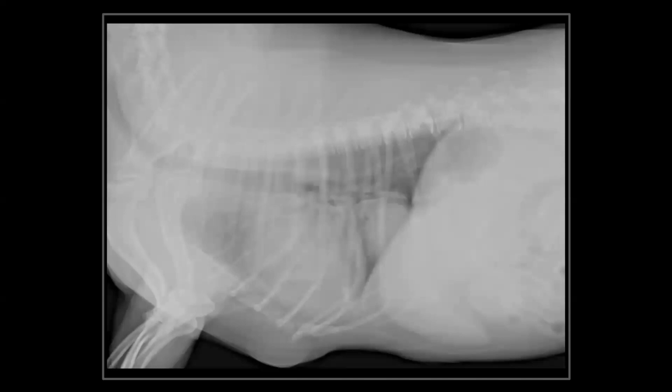Sorry, I just want to add as well, if you notice, these films are actual live cases. They're not all perfect. They're not the perfect exposure. They're not the perfect positioning, and that's okay. You can get a heck of a lot of information from films that are not picture perfect. And that's what we strive to develop with the systems, and the systems showed that films don't necessarily need to be perfect. I think, just as an aside, the bigger challenge we have is that when we have lots and lots of films taken on a study, folks sometimes tend to overtake the number of films. Typically you can get by with a maximum of 3 films per body section, which is typically all that you need.